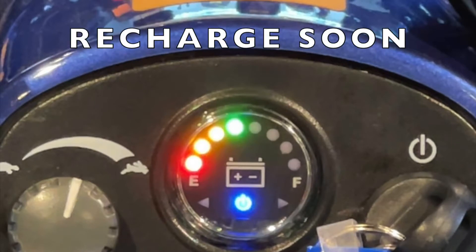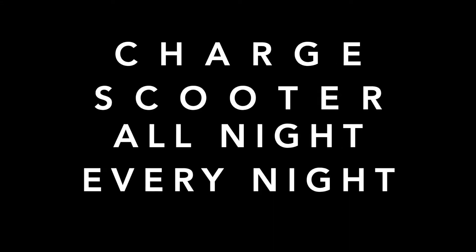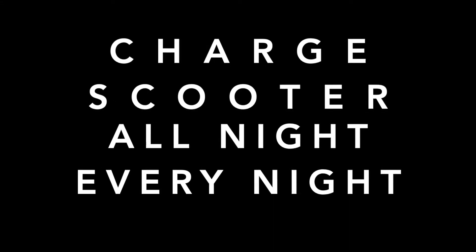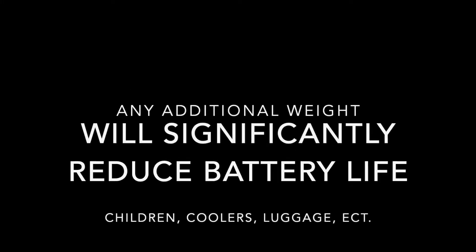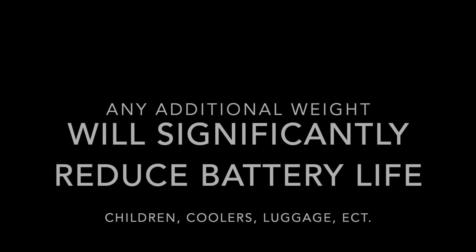When you're down to one steady green light, the scooter is telling you it needs to be recharged soon. Don't forget to charge your scooter all night, every night, regardless if you've used it. And remember, any additional weight added to the scooter will significantly reduce your scooter battery life.